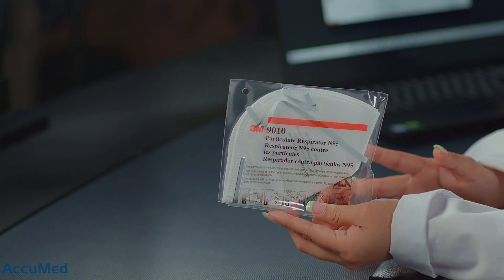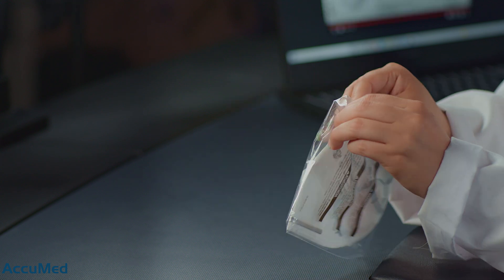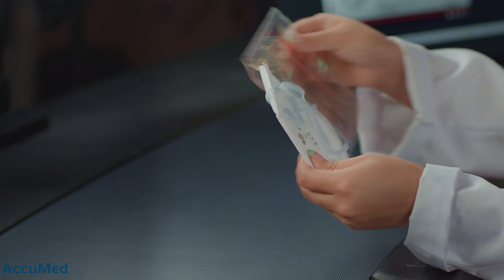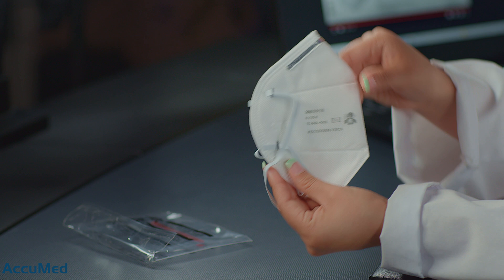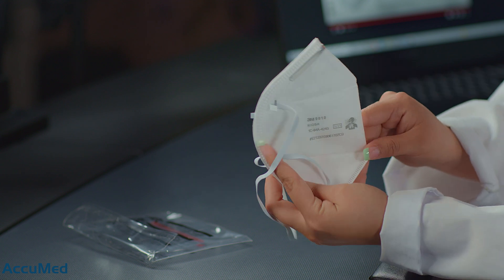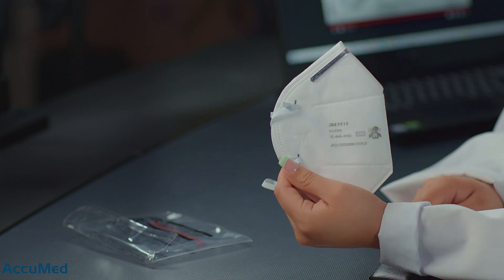Let's go ahead and open the box up and see how they look. They do come individually wrapped. This is how the respirator looks. It contains all the N95 requirements: the manufacturer, model number, NIOSH and the 95 stamp, the TC approval number, and the lot number.